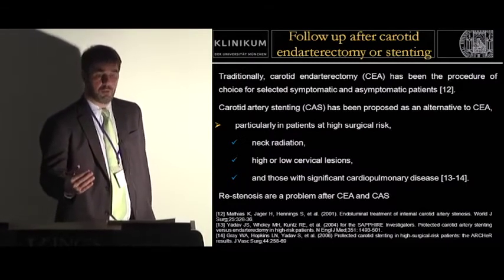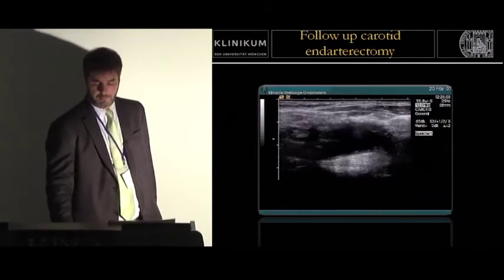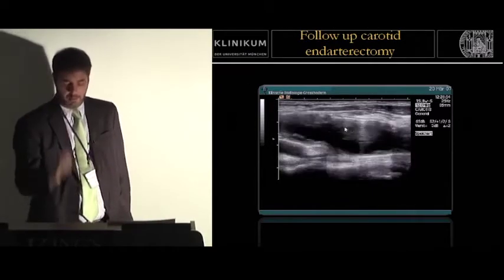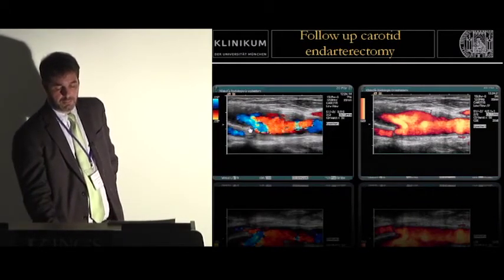After making the decision, you have to think about what will be the best therapy for your option. Should it be open surgery or should it be stenting? This patient underwent open surgery. You see the dilatation of the bulb here. You see some plaques here.